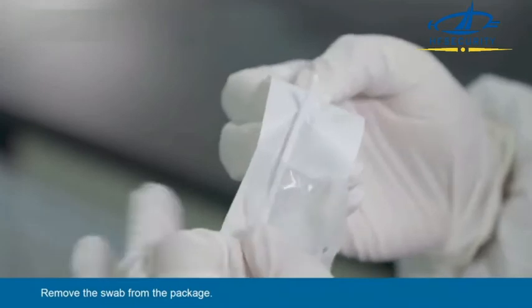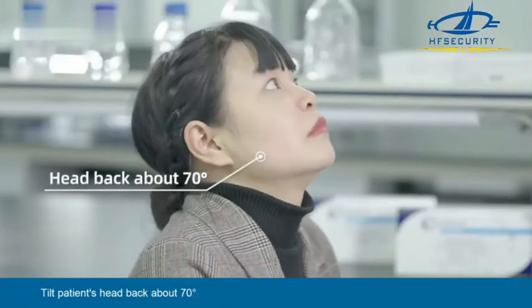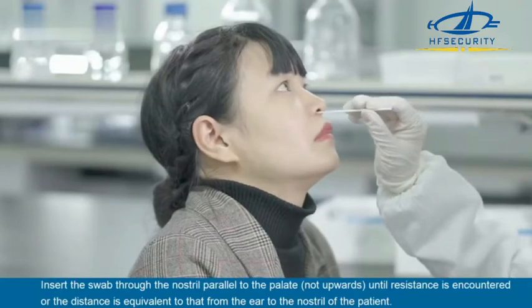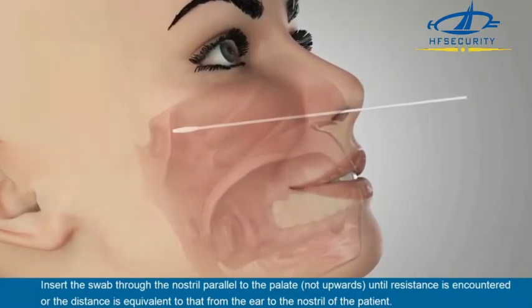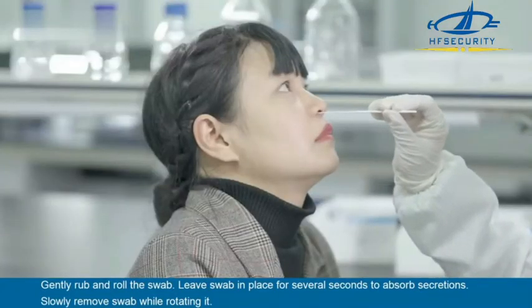Sample Collection. Remove the swab from the package. Nasopharyngeal Swab Sample: Tilt the patient's head back about 70 degrees. Insert the swab through the nostril parallel to the palate, not upwards, until resistance is encountered or the distance is equivalent to that from the ear to the nostril of the patient. Gently rub and roll the swab. Leave the swab in place for several seconds to absorb secretions. Slowly remove the swab while rotating it.